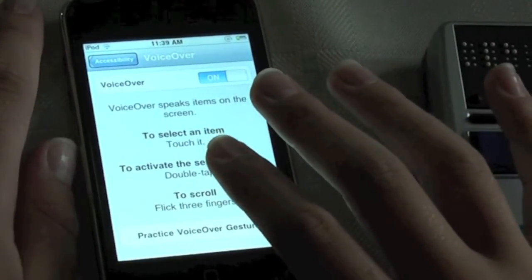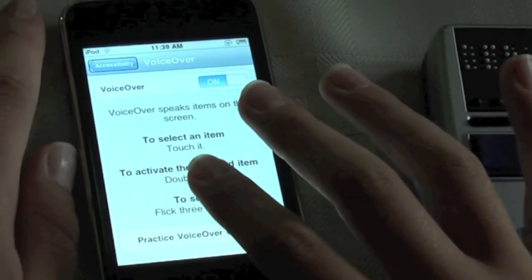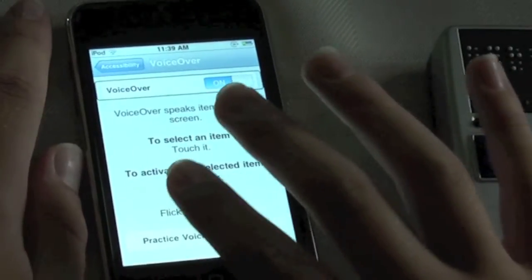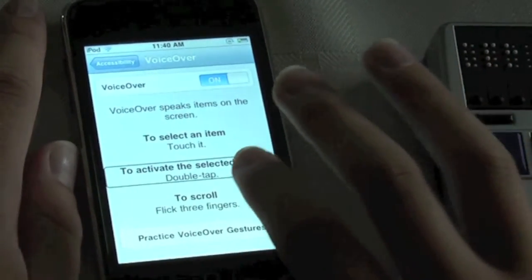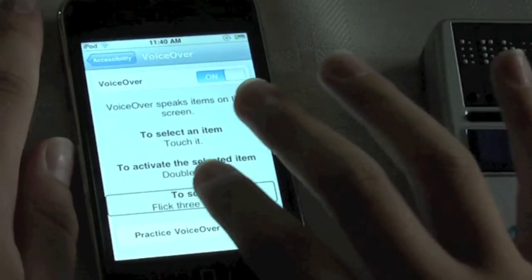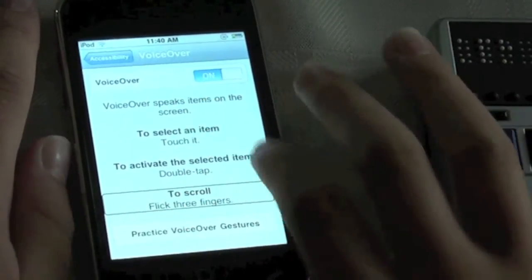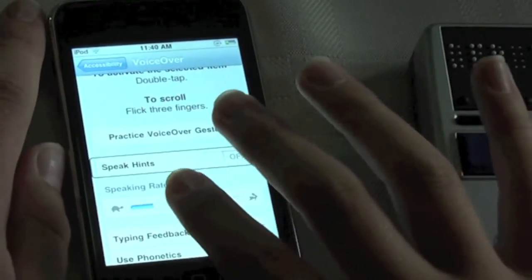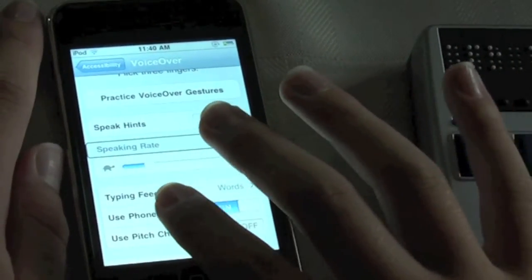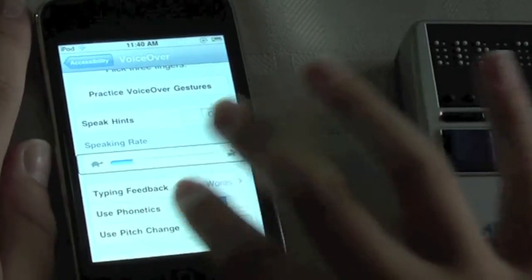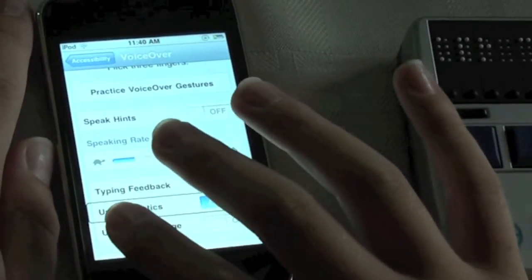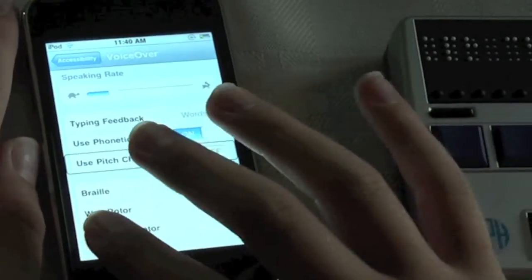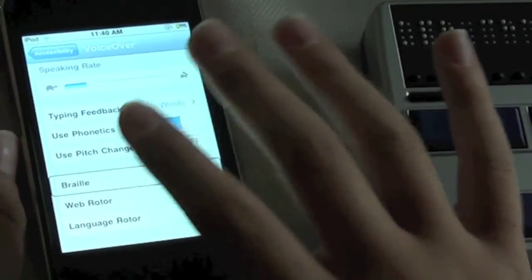And now we'll need to flick right until we get to Braille. I'm navigating through the VoiceOver settings including speak hints, speaking rate, typing feedback, use phonetics, use pitch change, and there's the Braille button. We'll double tap.